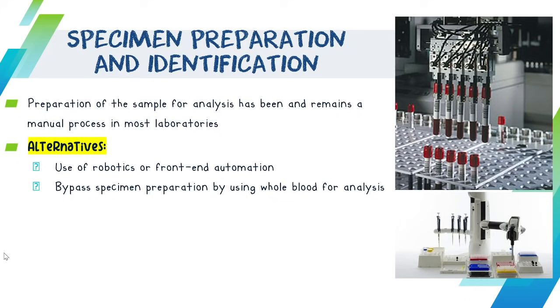Like, for example, instead of using serum or plasma, rather, just like your, say tawag ani, sa ABG, your arterial blood gas analysis, na ay mga samples or naming machine once na murag ipa-check sa amoa na whole blood ang amo ang gamito na. So kana, and even ang kato sa inyuha mga CRP na usually mga serum sample, ang ginapagamit na ana is sa mga machines na murag set up siya na whole blood na ang gamiton, kay it is actually very much easier if we will use that. But then again, as mentioned, natay pros and cons.